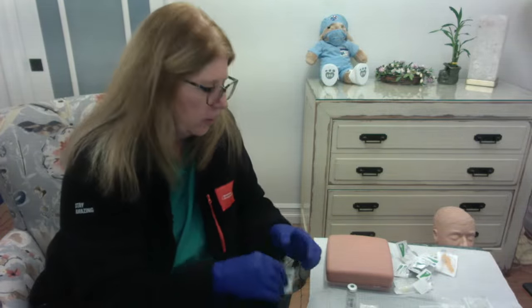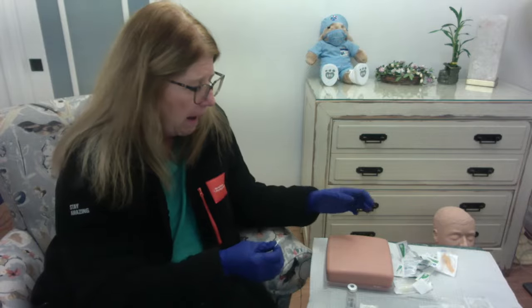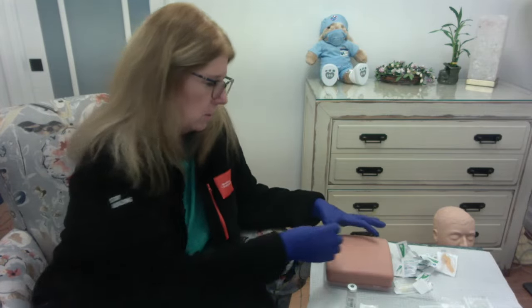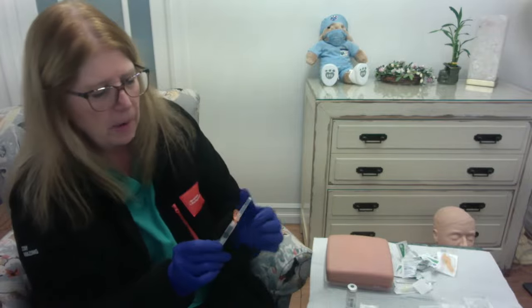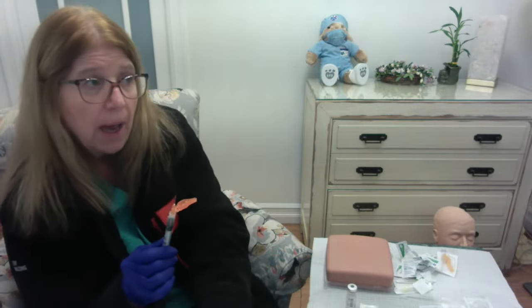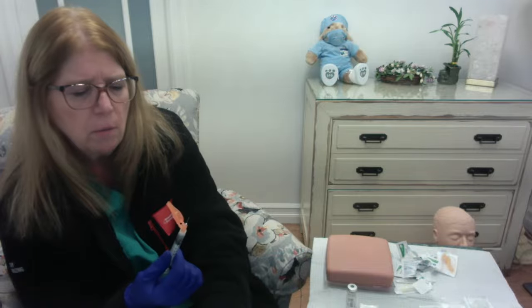So I'm going to explain to the patient. I'm going to choose my sub-Q area, and we're going to give it on the back of the arm here, okay? And I want to show you this at a 45-degree angle, right? So I'm going to clean the skin again from the middle out, let that alcohol dry, and remember, if I'm giving any injection at an angle less than 90 degrees, I've got to do bevel up, okay? Bevel up. So bevel is up.